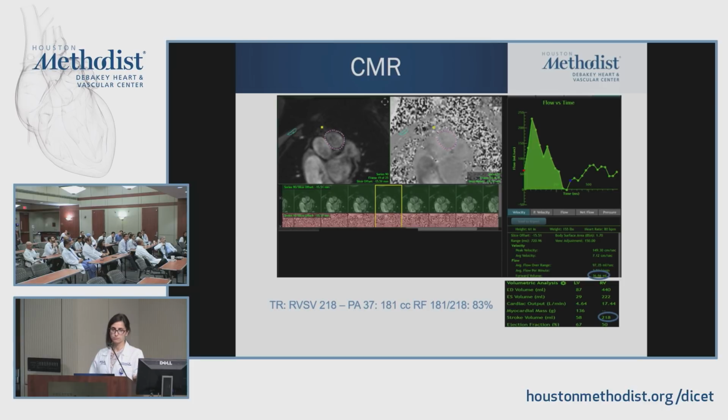Correct. Now you wonder, and I don't know, I doubt it, but you wonder whether in low flow mitral stenosis you have an over-exaggeration of a lower valve area, similar to aortic stenosis. I doubt it, though, because there's always a gradient that opens up this valve. Is there any flow dependency of the opening? I don't know that. I think the only way you're going to know is if you do a little experiment by stressing somebody and looking at the flow. We could do that here, and see what happens to gradients, and to the ratio of VTI to gradient, something like this. Okay.